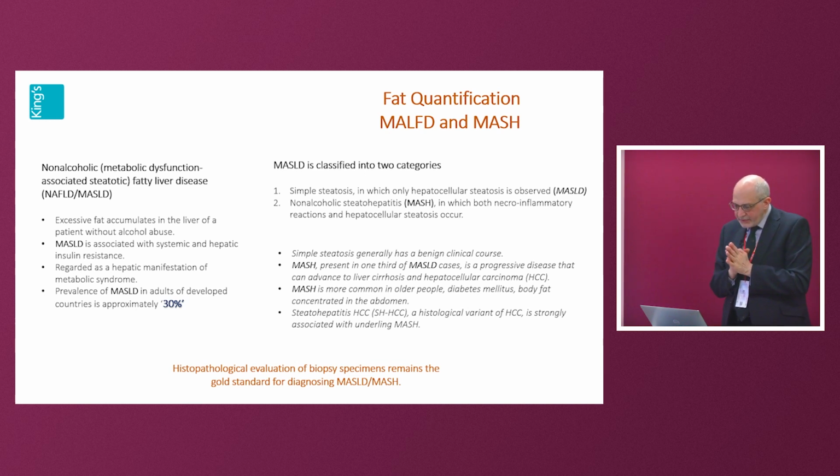MASLD is simple steatosis, and there's no inflammation in the liver at all. You can't actually see that with your ultrasound examinations at the moment, but this is going to change. Viscosity measurements may change over time to actually allow you to measure inflammatory change. But the hepatitis, the MASH as it's called now, can be present in up to a third of patients with steatotic liver. And this becomes more important because it then puts you at risk for HCC.